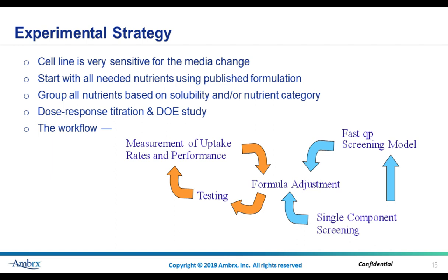At the very bottom, you start with the single component screening, then go up to the screening model, then you adjust your formulation, and then test, then measure your uptake rate and performance. After several rounds, eventually you will succeed.